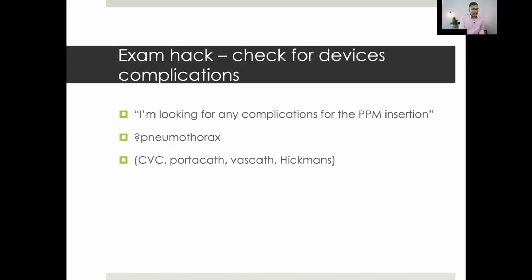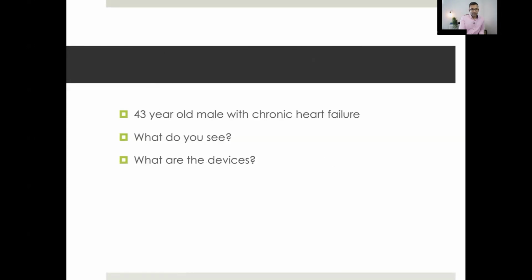So think of CVCs, Portacaths, Vascaths, Hickmans, whatever they are around the chest, really just say that you're looking for a pneumothorax because it is very relevant to us. And I can just imagine that being pretty important in the exam.